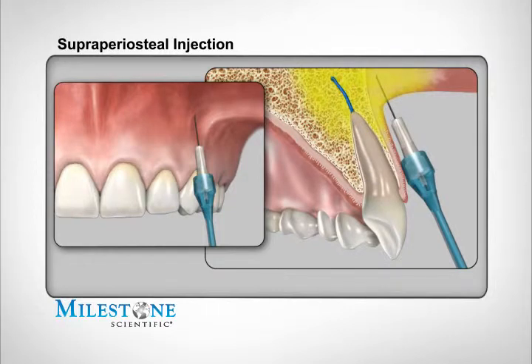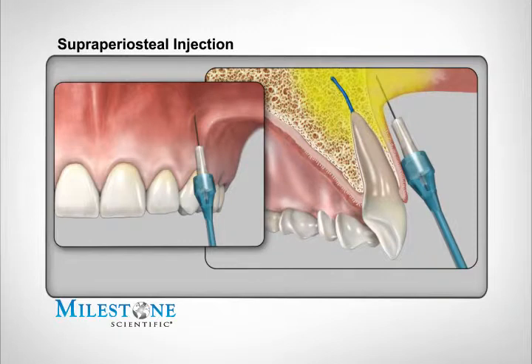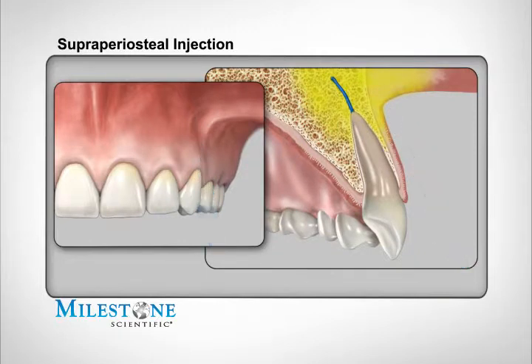To avoid anesthetic solution spray back into your patient's mouth, perform the following. While the needle is still embedded in the patient's tissues, depress and release the foot control pedal. Count 3 beeps after releasing the foot control and then totally remove the needle from the patient's mouth. Direct the needle away from the patient as a small amount of anesthetic solution may still be present. Should you require more than one anesthetic cartridge, you can reload subsequent cartridges and continue as required. Please see the section on multi-cartridge technique.